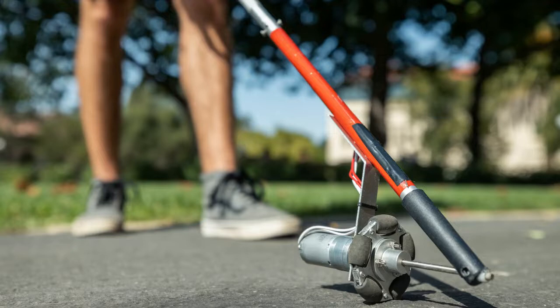The scholars are open sourcing every aspect of the project. Anyone can go and download all the code, bill of materials, and electronic schematics all for free. But the cane is still a research prototype. Next steps for the team include refinements to their prototype and developing a model that uses an everyday smartphone as the processor, and advances that could improve functionality, broaden access to the technology, and further drive down costs.